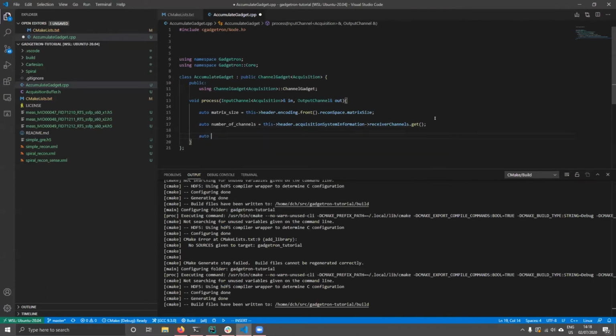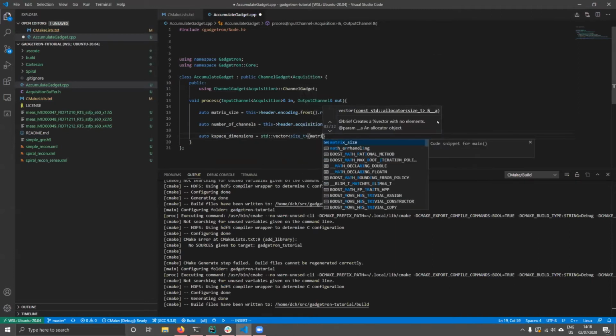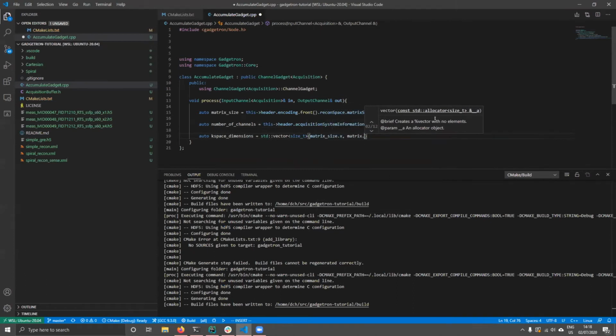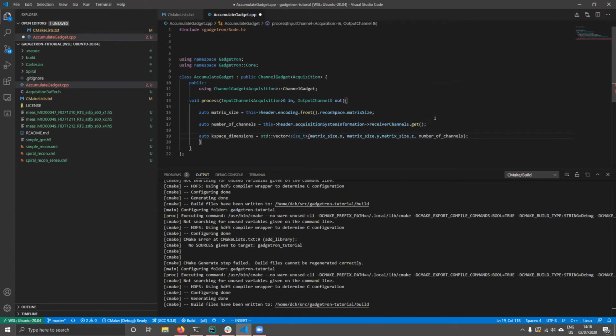So finally, we have everything we need to assemble some dimensions. We take the matrix size X, Y, and you guessed it, Z, and then we have the number of channels. Okay, so that was a lot of preliminary exercises. Now we want to actually start grabbing things from the input channel. So the input channel and the output channel, they're very similar to the connection that you saw for Python and MATLAB. Just rather than having one, we have it separated into input and output.